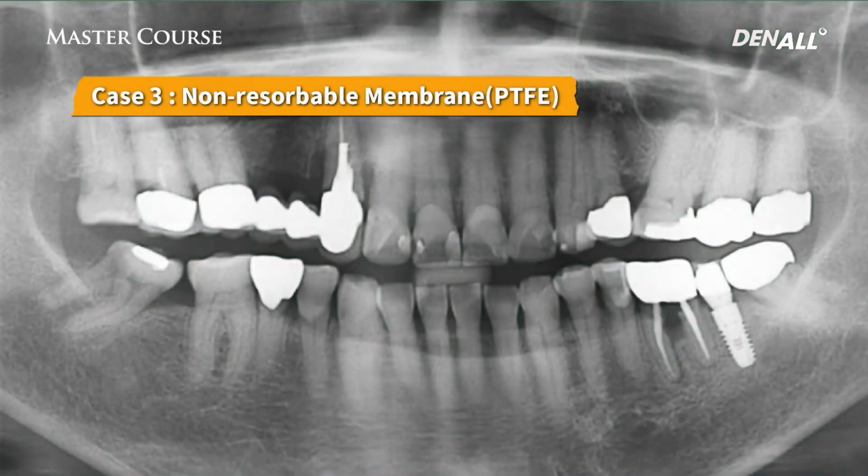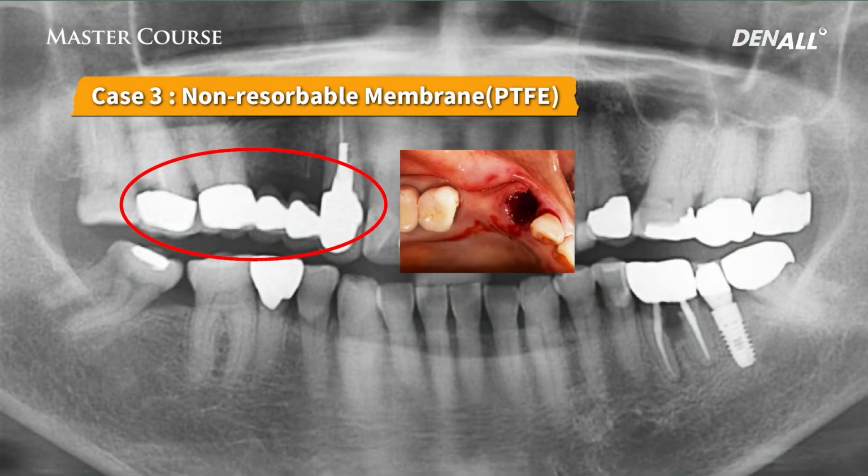In upper right quadrant, in number 4 bridge, there was a problem and tooth number 13 was extracted. The root was very deep, so it was difficult to do immediate implant placement. In number 13, socket preservation was done. In 14 and 15, immediate implantation was done.